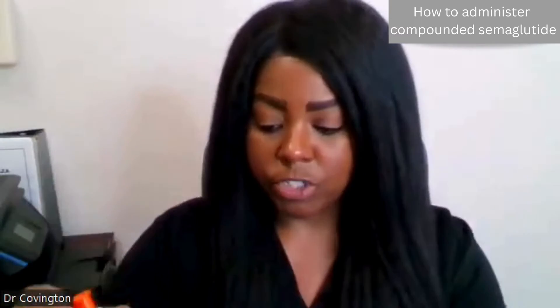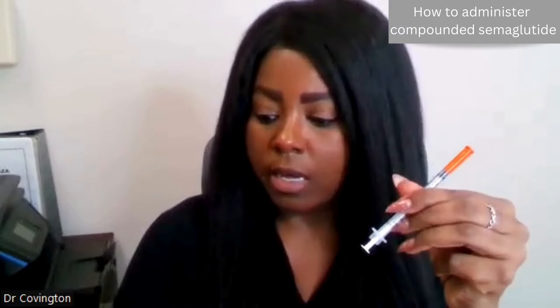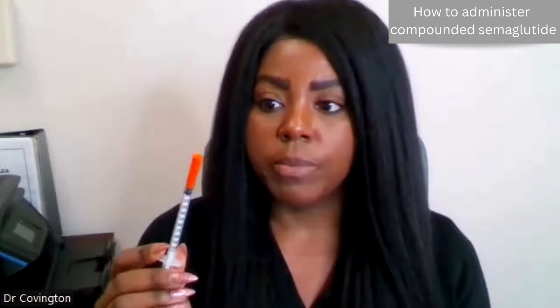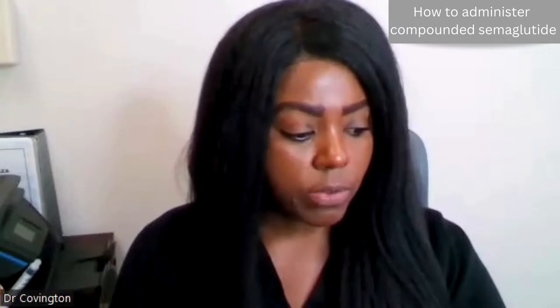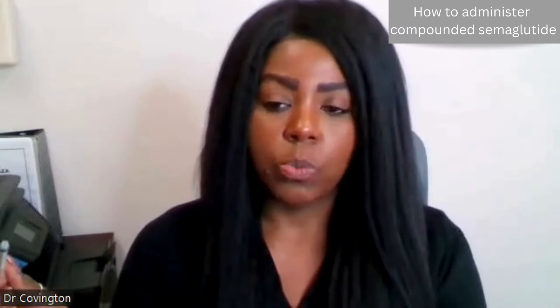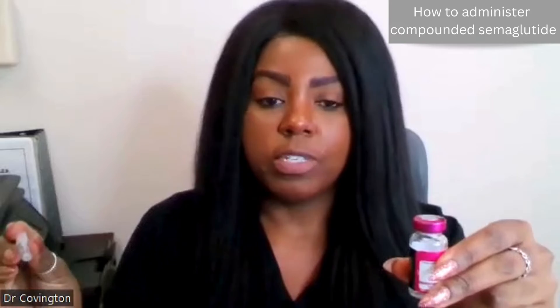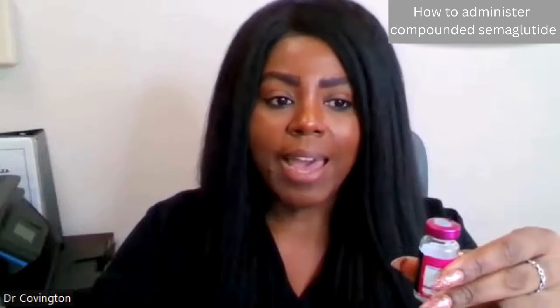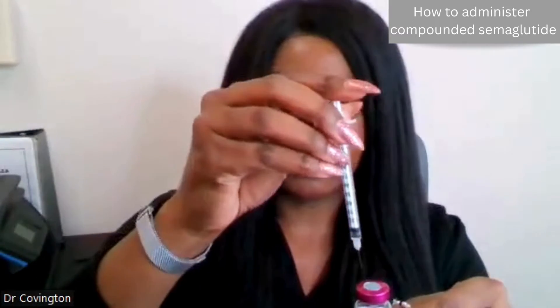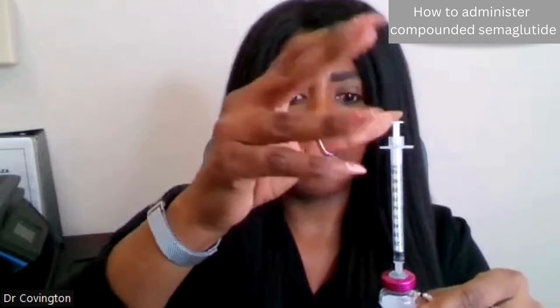When I'm doing this type of injection, what I do first is take off the back from the plunger. The last step that I do is actually to expose the needle, because I want to do that step last so that you don't accidentally stick yourself. Now we've got a live needle that is unsheathed. The easiest way I believe to do this would be on a solid, immobile surface — don't raise it in the air if you don't need to. I'm just doing this so that you can see. Easiest way is to put the needle in with this stable and go all the way in.